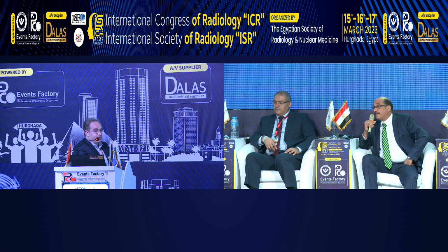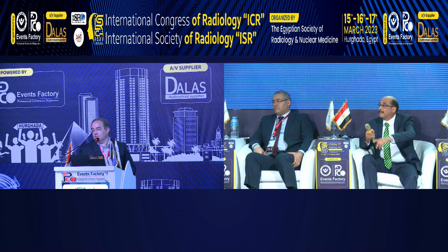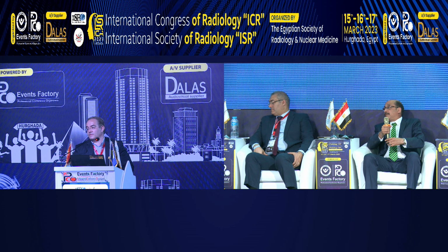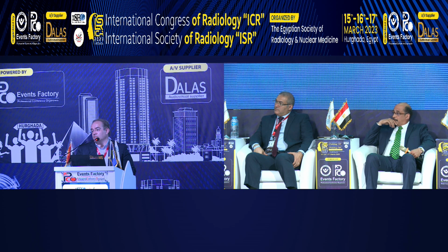Any other questions? Thanks for the nice talk. We know that gel foam, when applied into arteries, will dissolve after 48 hours. Do you know whether this dissolves, or do you have follow-up imaging where it's gone, or does it stay?